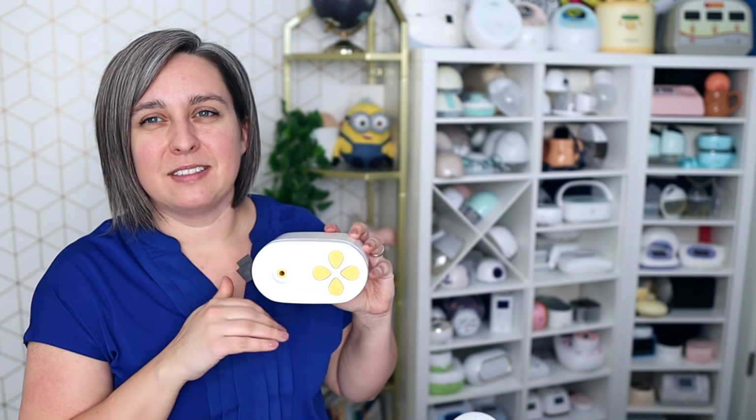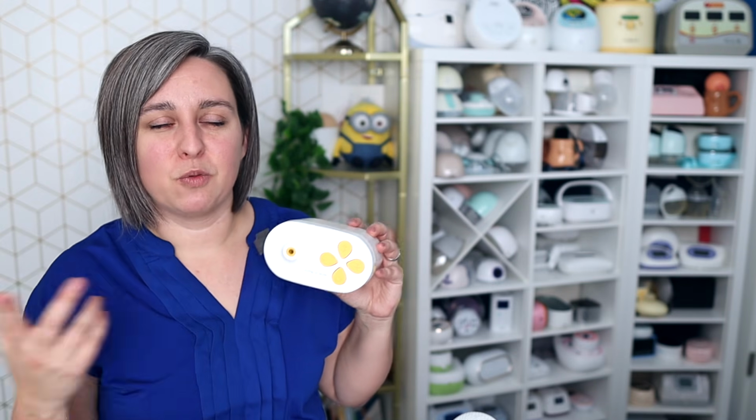And this one makes zero sense to me because you still have to plug this into a wall. So yeah, your hand's free now with a cup, but just use a regular flange. It's going to be so much better, especially with this pump that is not one of my favorites. So while that is kind of a unique thing, some pumps are doing that now where they're just coming with cups. Not my favorite thing. There's a few that I can think of.